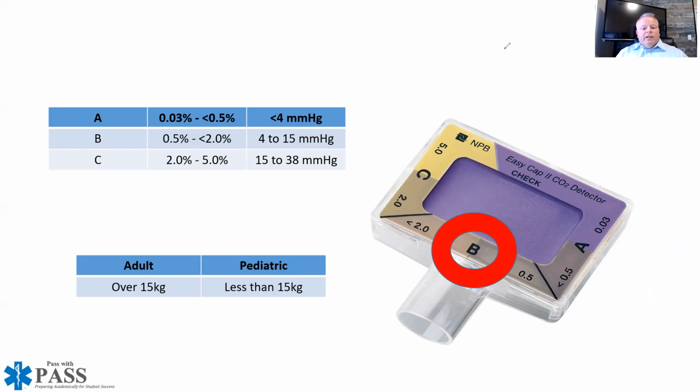And I'll bet unless somebody has actually taken the time to either A, teach this in a class to you, or you've taken the time to read the package insert, most of us, me included, I'll be honest with you, most of us have probably not taken the time to actually look at this. Now, I did years ago because I started teaching capnography and I wanted to be educated on the colorimetric device. But had it not been for that, I probably would still be using this thing today inappropriately.